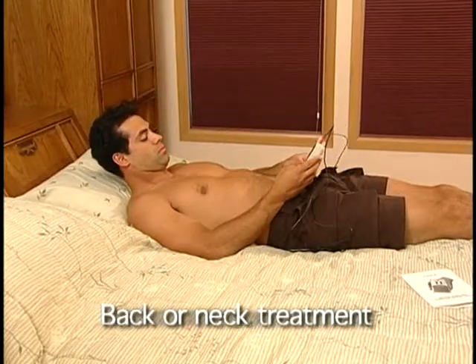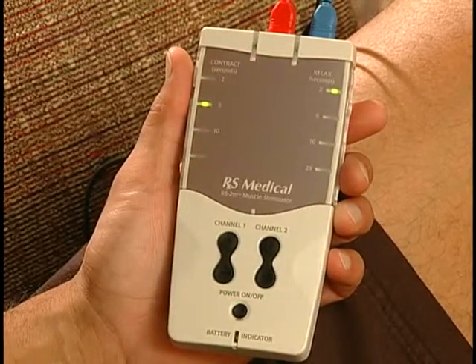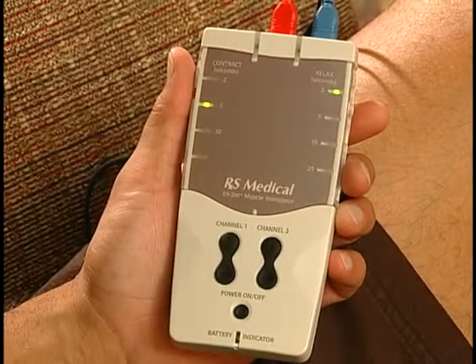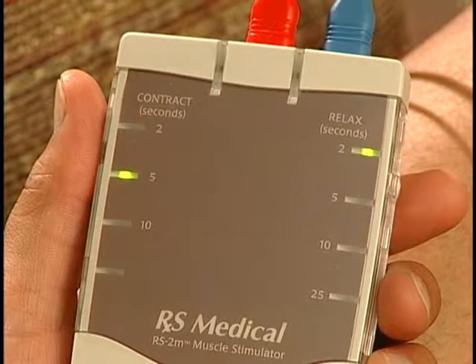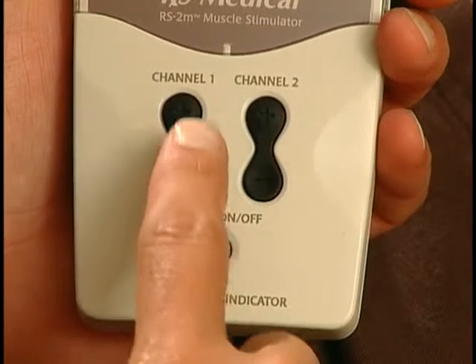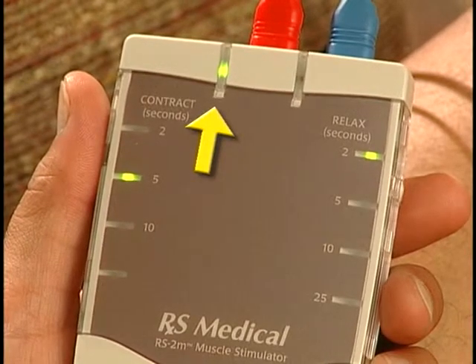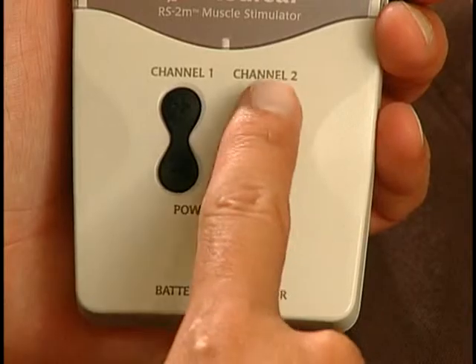Now you are ready to take a treatment. Press the power on-off button to turn on the stimulator. All lights will flash green and the light next to your treatment setting will remain lit. The stimulator is programmed to contract and relax your muscles. The treatment setting on the left determines the amount of time your muscles will contract, and the settings on the right determine the amount of time your muscles will relax in between contractions. Use both channel keys to control the intensity of your treatment. The channel 1 key controls the intensity of the stimulation being delivered to the channel 1 pads, and the channel 2 key controls the channel 2 pads.